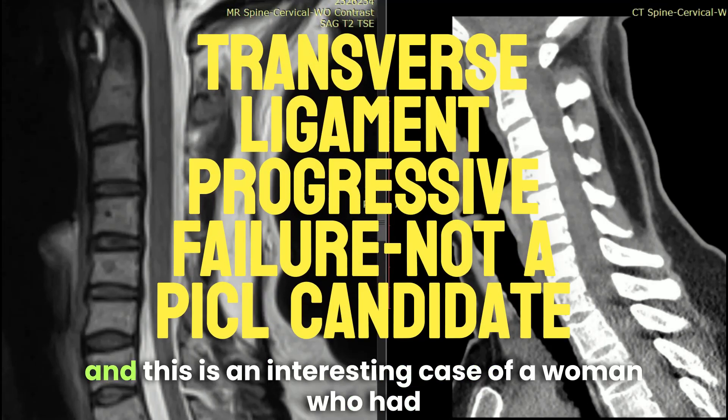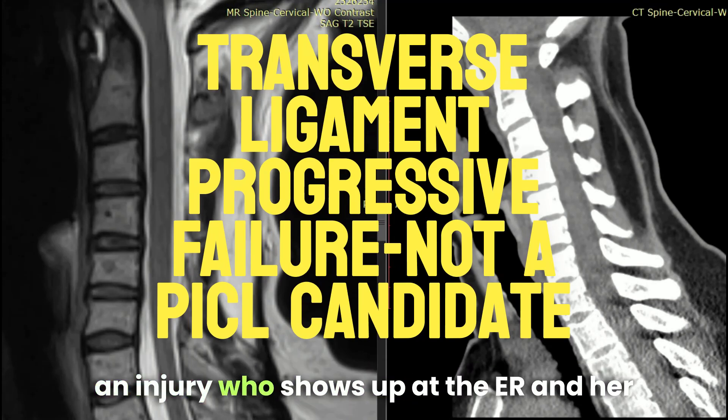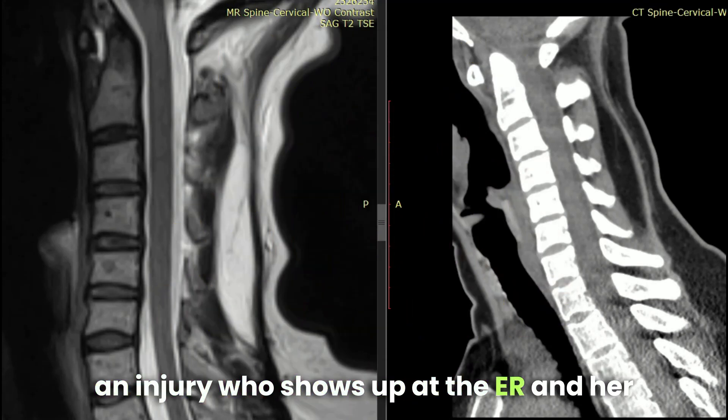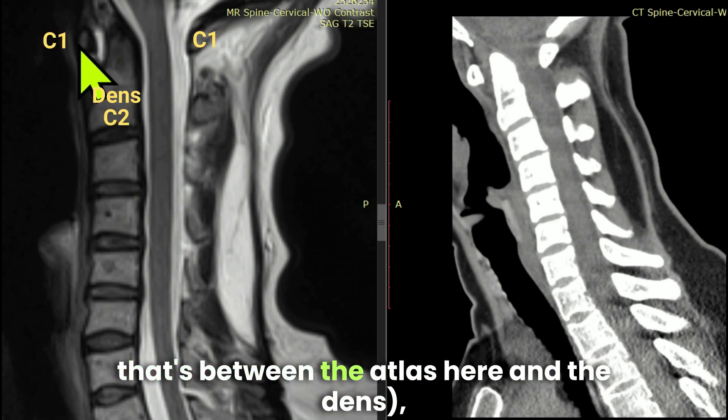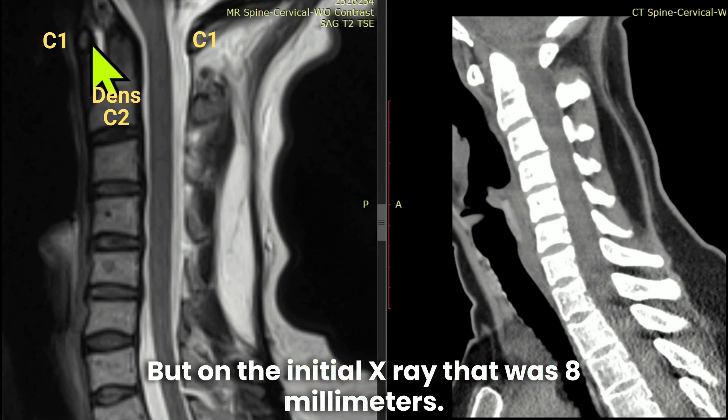Hi, it's Dr. Centeno. This is an interesting case of a woman who had an injury and shows up at the ER. Her atlantodental interspace, or ADI — here the ADI is white — is between the atlas and the dens, and on the initial x-ray that was eight millimeters.